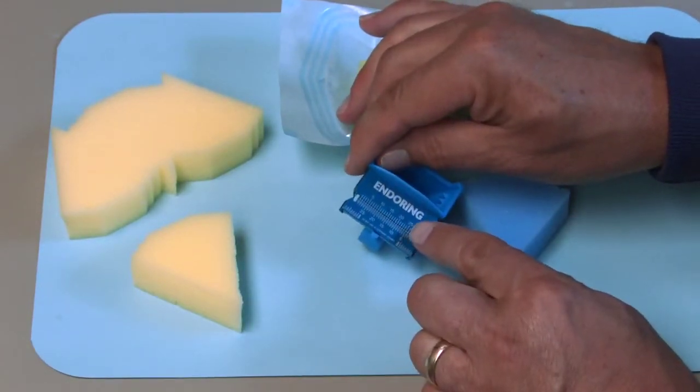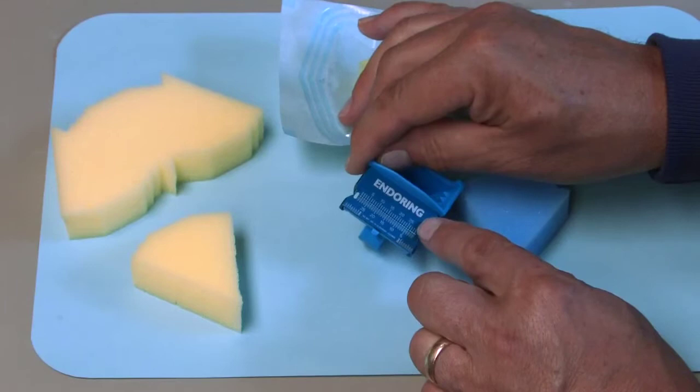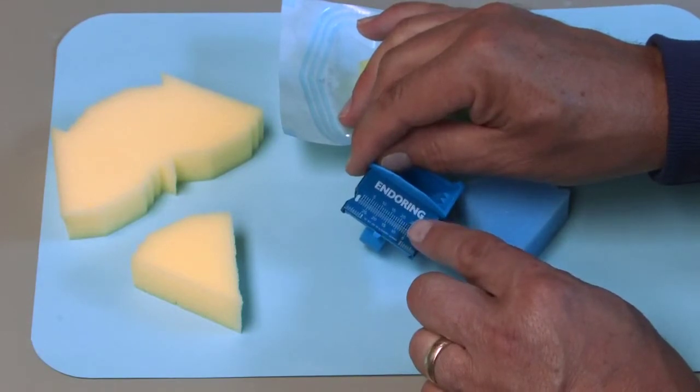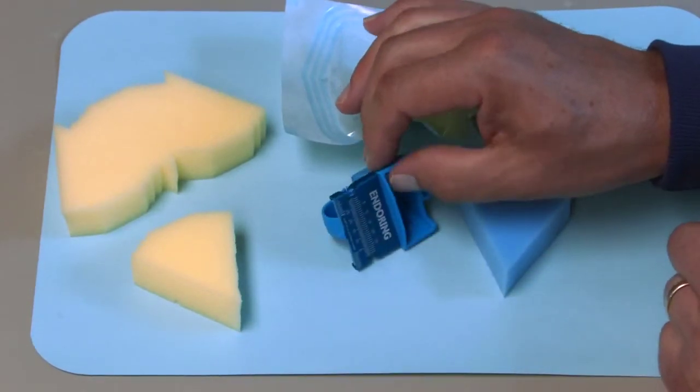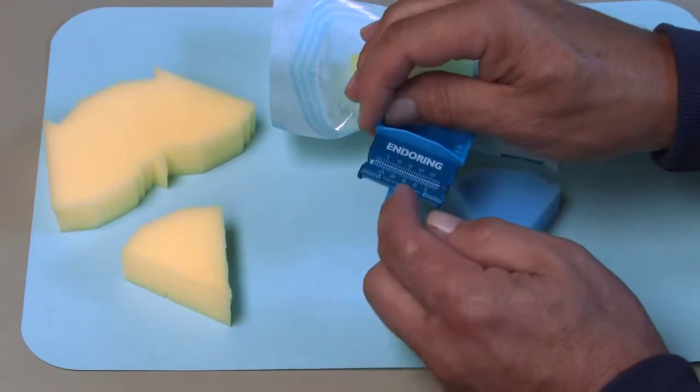It is important to note that the first time the Ender Ring 2 is autoclaved, the metal ruler should be attached to the Ender Ring 2. On all subsequent autoclavings, we recommend that the metal ruler be separated from the Ender Ring 2 in order to maintain proper retention of the ruler to the Ender Ring 2.